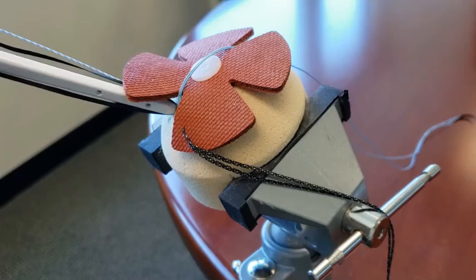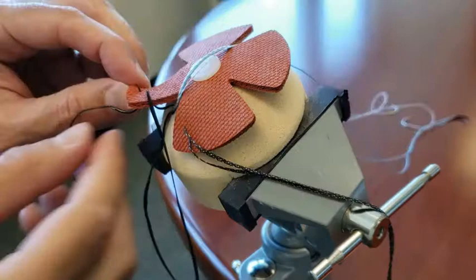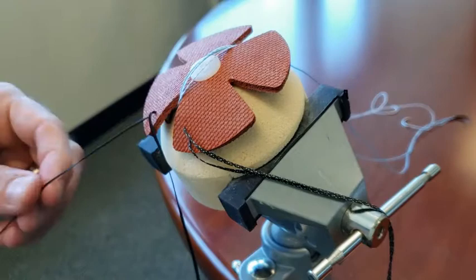You'll remove your pull tab and yoyo and get your limbs out of your way. Next we're going to pass the needles in the same manner as we did on the first anchor, just in the opposite directions.